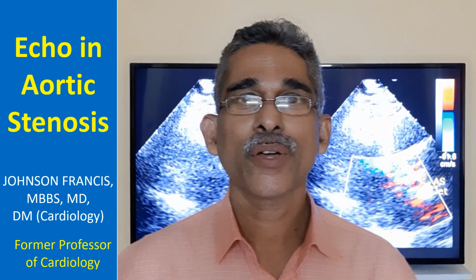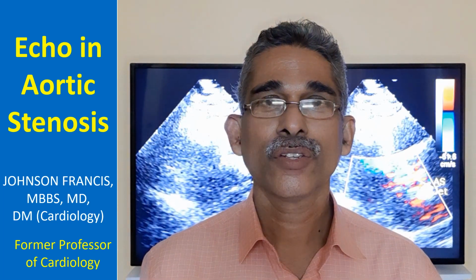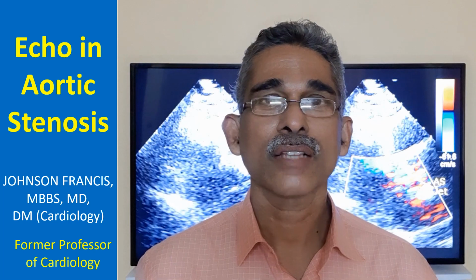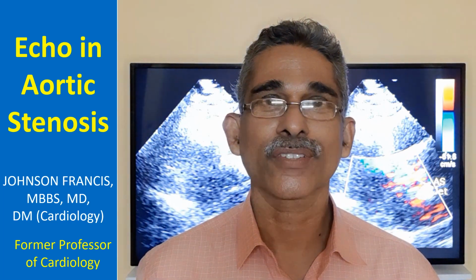Now I am going to discuss a few echocardiograms in aortic stenosis. First we will see 2D echo. Along with it there will be a color Doppler display as well and a Doppler echo in aortic stenosis. We will also discuss something about low flow, low gradient aortic stenosis.